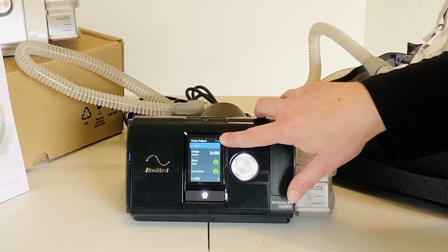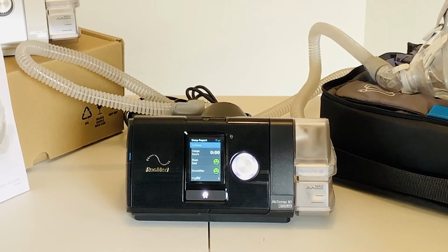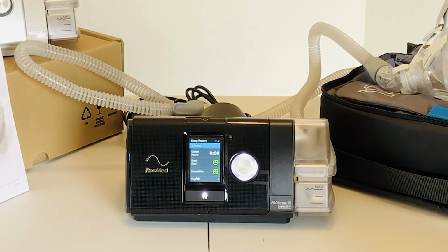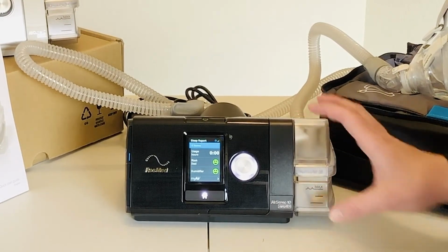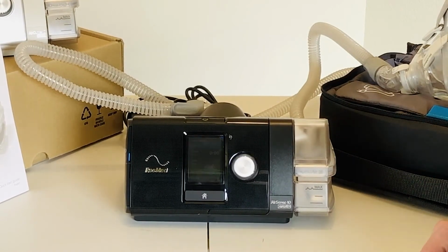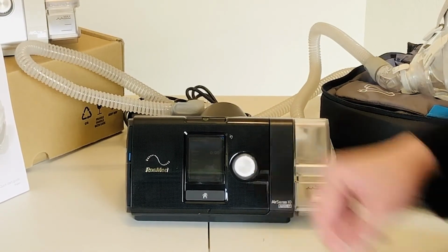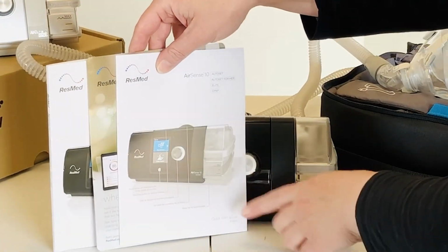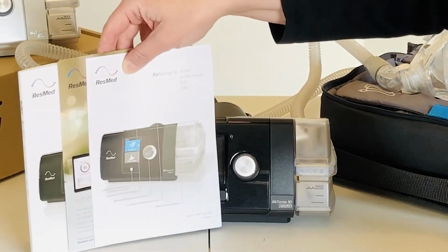The flashing blue snowflake means the machine is in cool down mode. This cool down mode runs for 20 minutes. It is suggested at that time that you do dump the water reservoir and air dry the chamber. If you have questions, please refer to your owner's manual and your quick setup guide or your provider.